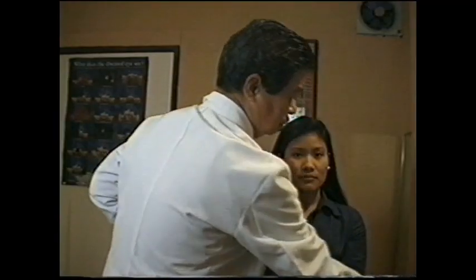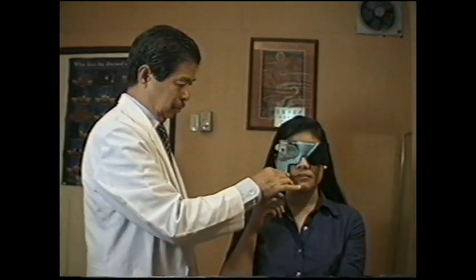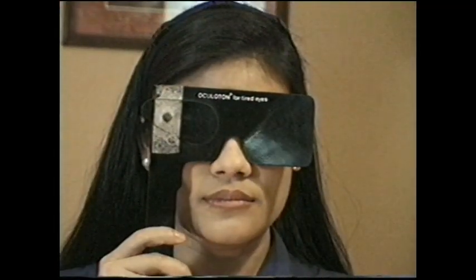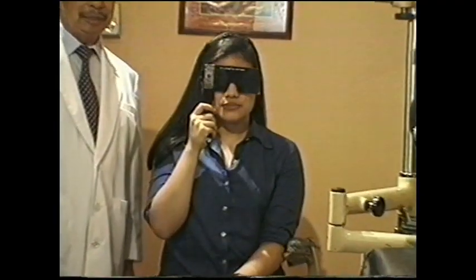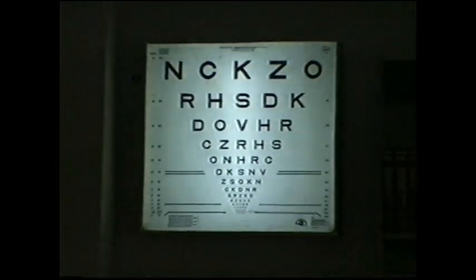Now, testing for pinhole visual acuity. Number 1. Position the patient and occlude the eye not being tested, as done for the distance acuity test. Number 2. Ask the patient to hold the pinhole in front of the eye that is to be tested. Number 3. Instruct the patient to look at the distance chart through the pinhole.